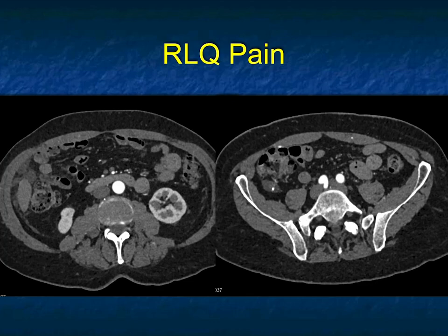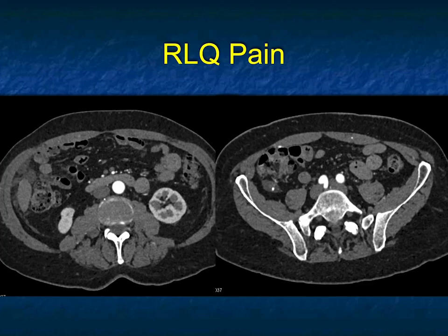What about this case? Looking at the image on the right, you see what looks like a dilated appendix with calcification. Are we simply dealing with appendicitis? You see there are some implants in the right lower quadrant, as well as a thickened dilated structure. The implants are best seen on the image on the left, around the inferior liver and in the left flank. So what else could this be? I would love some coronals and more images, but that's the game — you only have two images.